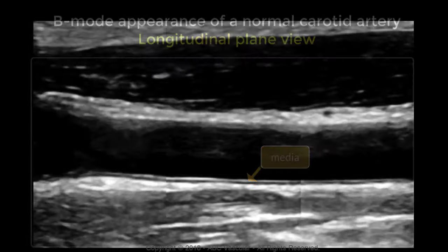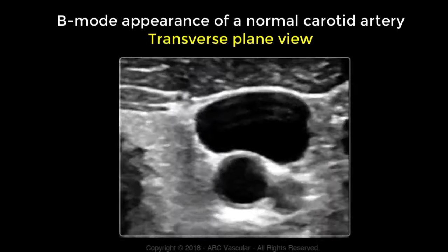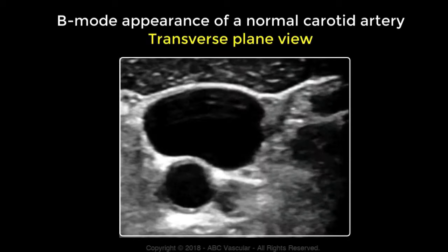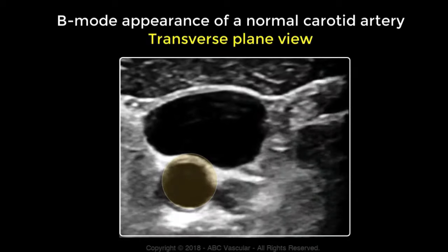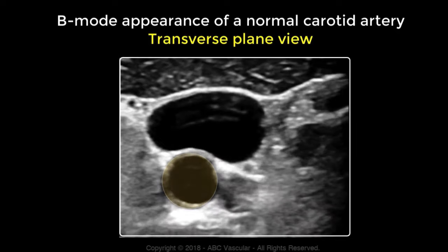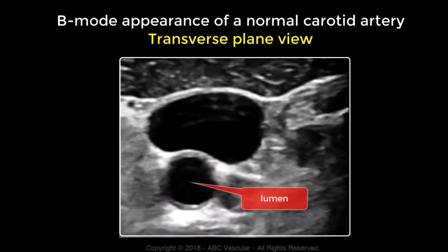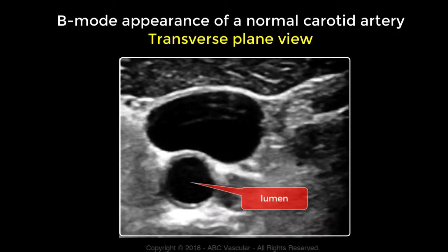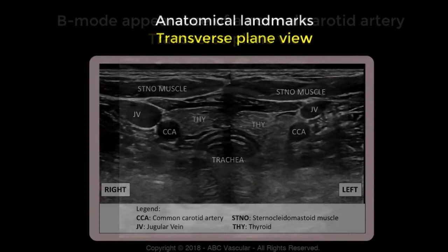The ultrasound appearance of the artery using a transverse plane is different from the longitudinal one. In transverse view, the artery appears as a cross-sectional area, as indicated by the yellow circle. As in the longitudinal view, the lumen is anechoic while the walls are hyperechoic.